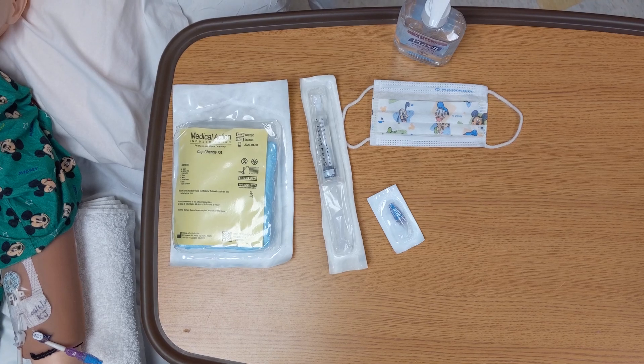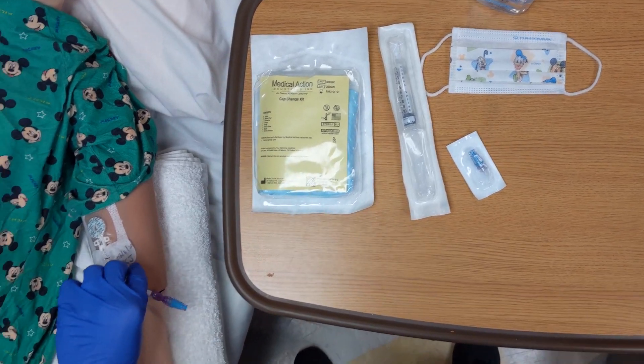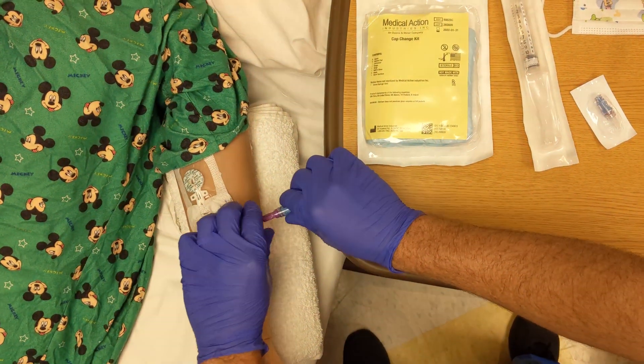Ensure that the injection cap can be loosened prior to starting the sterile cap change process, but clamp the lumen first.